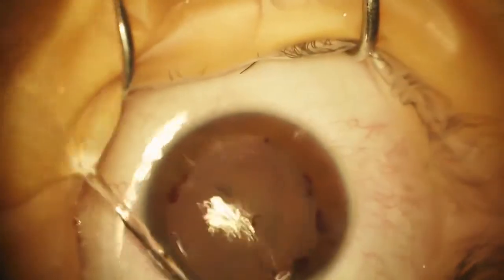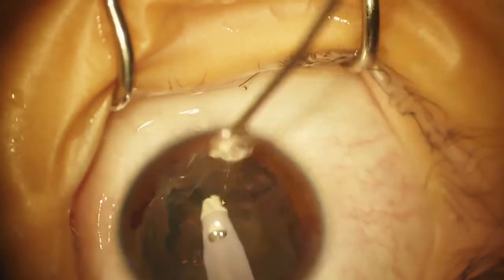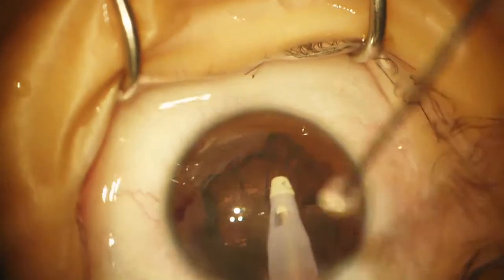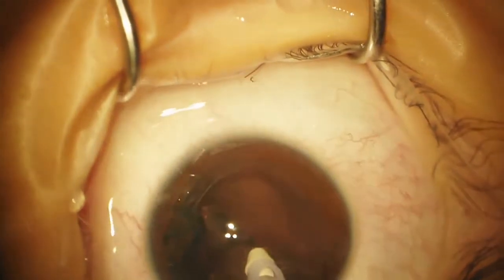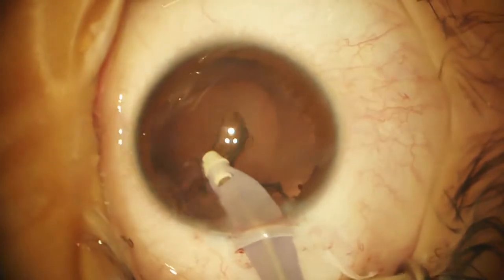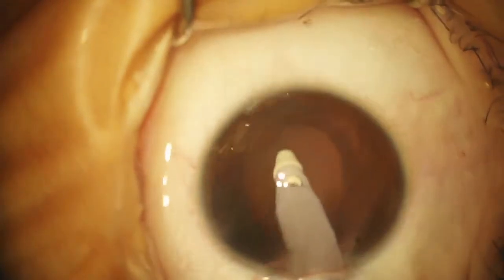Because this is going to be very soft, we're just going to use I/A — we don't need any phaco power. Once again we'll use continuous irrigation. I could have hydro-dissected but it's really not necessary because it's soft enough — it's like doing I/A for cortex. We just sort of work around it, and as we thin it out it'll fold in on itself on its own. We'll remove some of the little strands of cortex and polish.